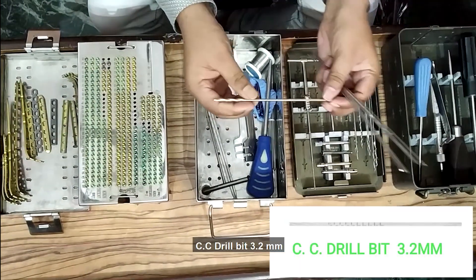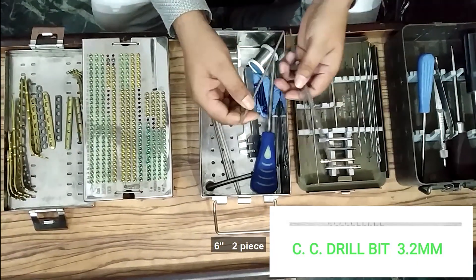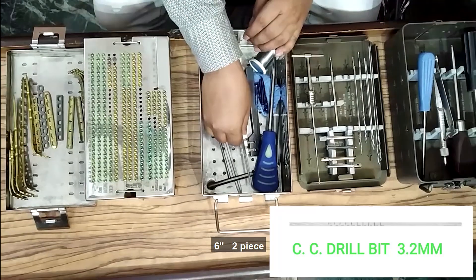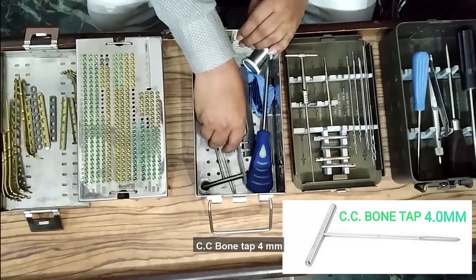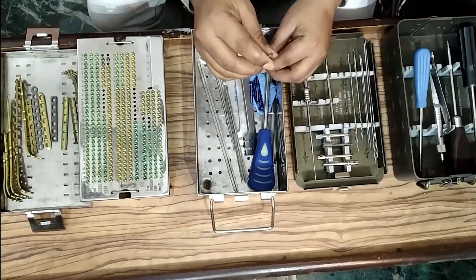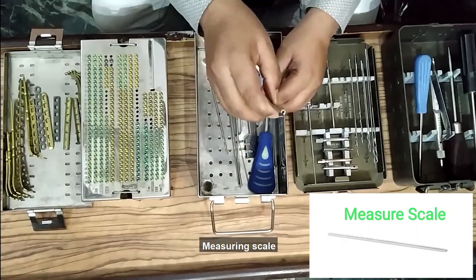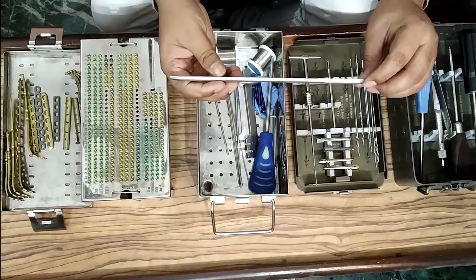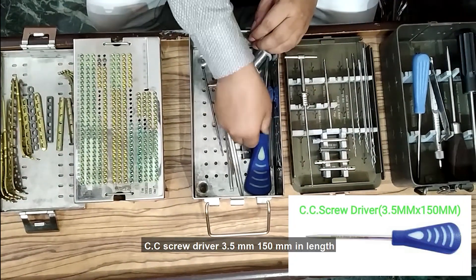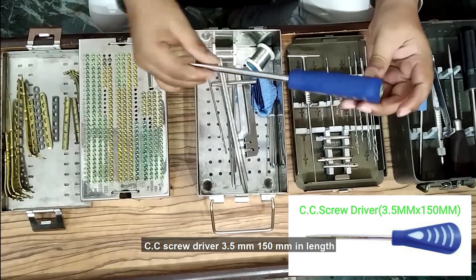QC drill bit 3.2 mm, 6-inch, two pieces. QC bone tap 4 mm. Measuring scale. QC screwdriver 3.5 mm, 150 mm length.